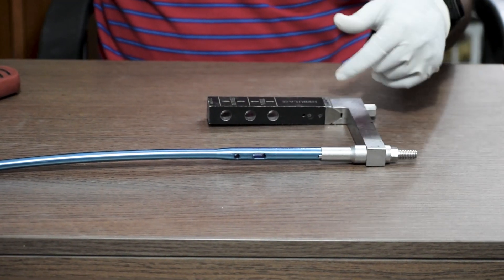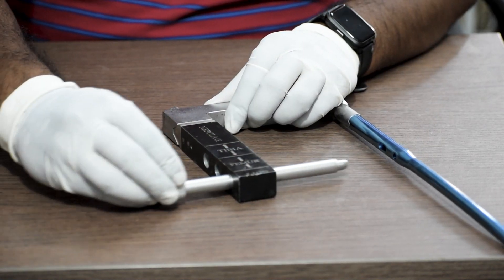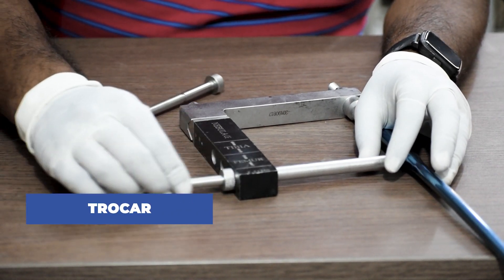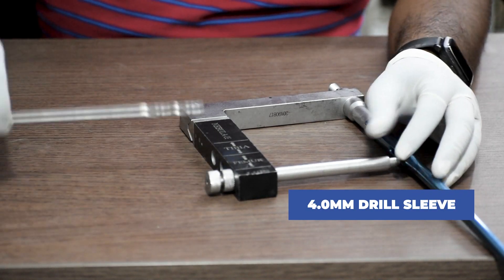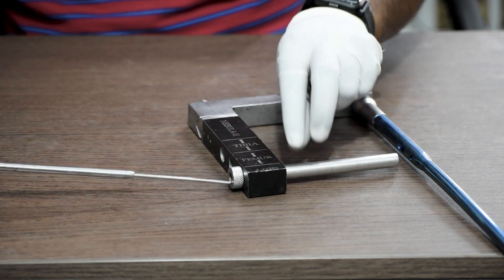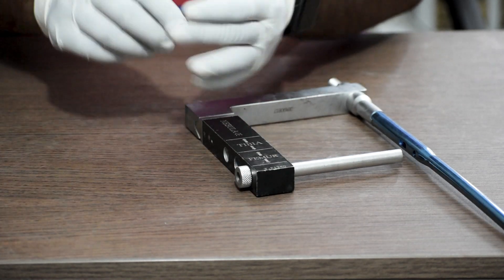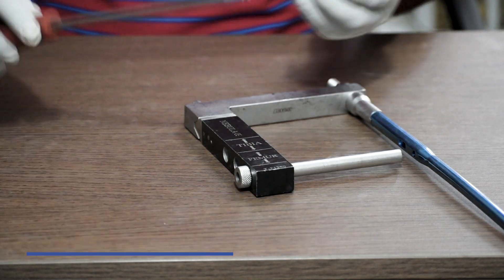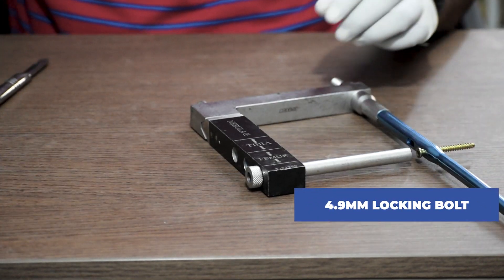Thereafter, we will lock the proximal end of the nail. We first insert the protection sleeve, then use the trocar inside the protection sleeve to clear out any soft tissues. Then we insert the 4 mm drill sleeve inside the protection sleeve and drill with the 4 mm drill bit. Once drilling is done for each hole, we use the depth gauge to take the measurement. For the jig, we use a 4.5 mm solid screwdriver — 200 mm long handle — and with it we fix the 4.9 mm locking bolt through the protection sleeve.